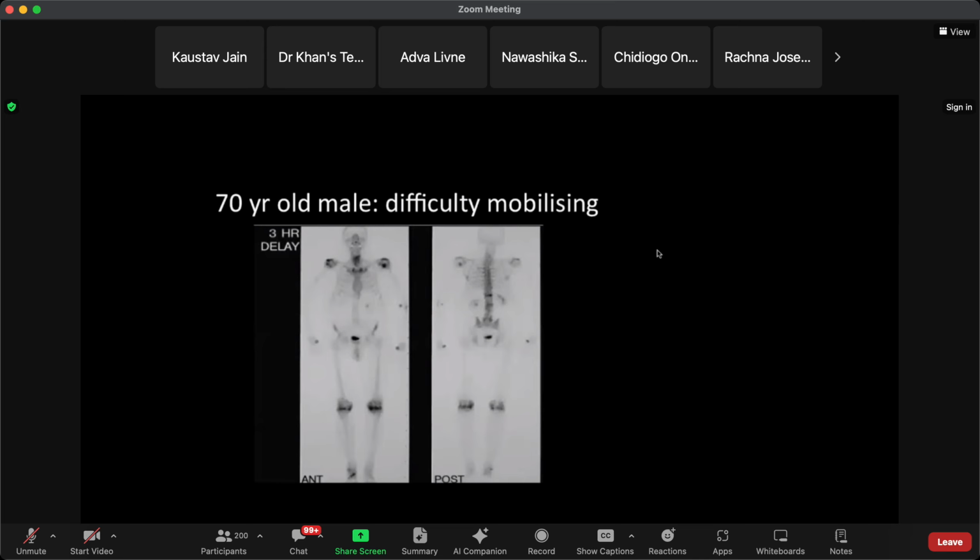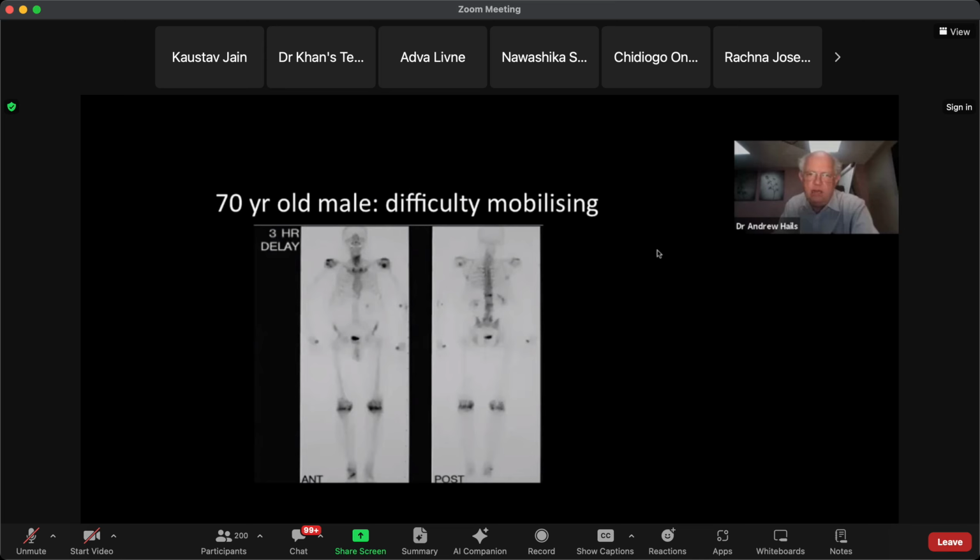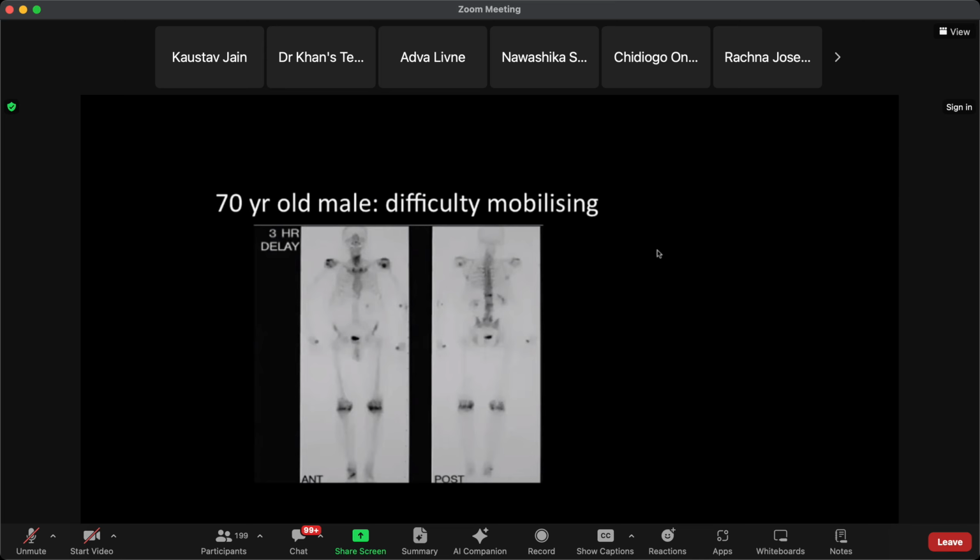So they've got arthritis in the knee joints. Yes. And in the shoulder joints as well, but predominantly the knee joints. We've lost the disc space, we've lost the joint spaces, so in the weight-bearing joints.